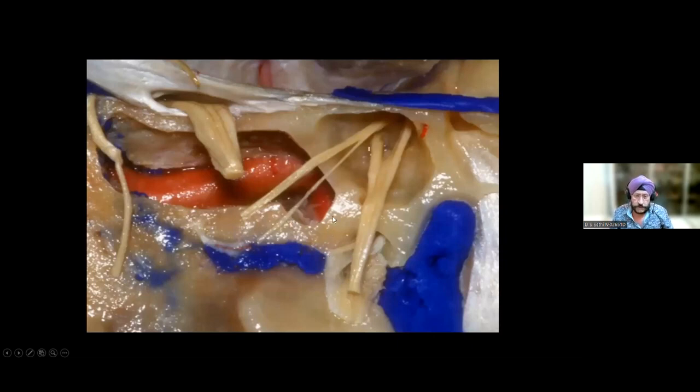Beautiful demonstration of the petrous part of the internal carotid artery. Like Satish mentioned, it enters here, it has a short vertical segment, then has a genu, and comes in right here, and another genu here, and it goes up here. Okay, this is a beautiful demonstration. And these are the contents of the petrous part of the temporal bone. Look at the cavum trigeminale, the fifth nerve cavum, as we call it. And this is the sixth nerve, and this is the fourth nerve right here.